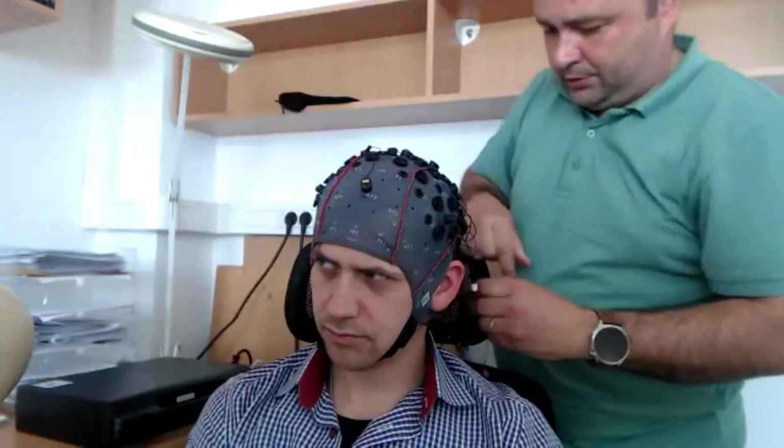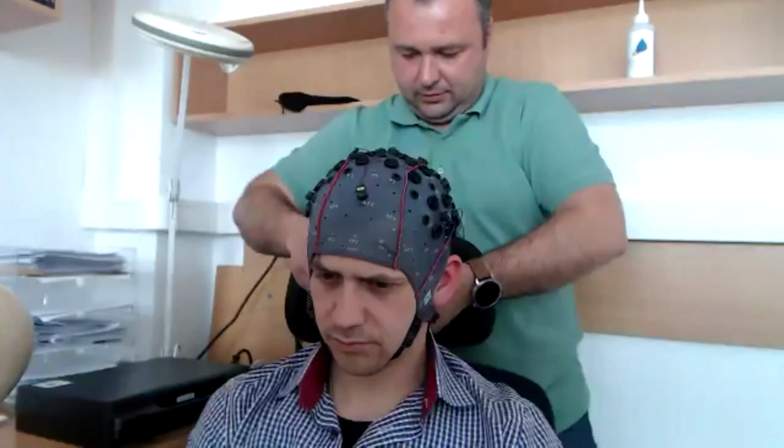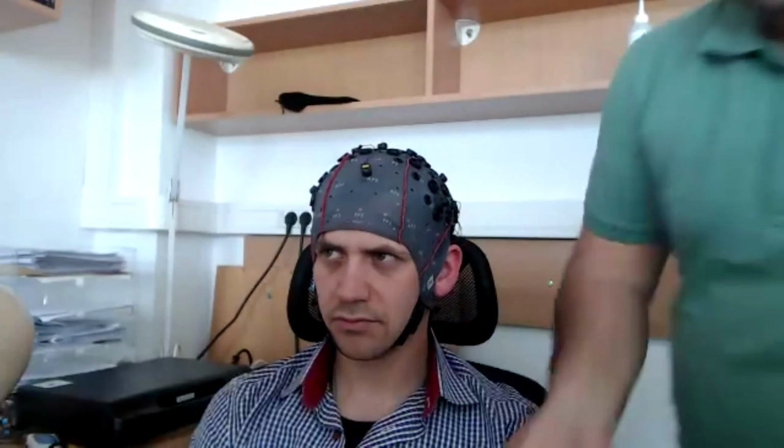So now all the optodes are off, nicely here, gently on the table.